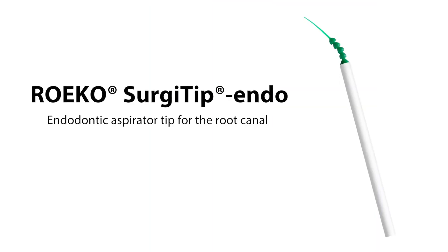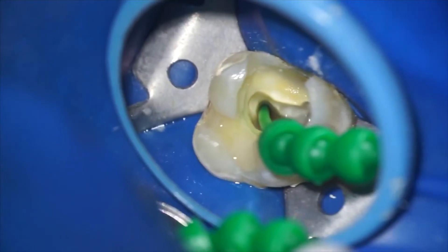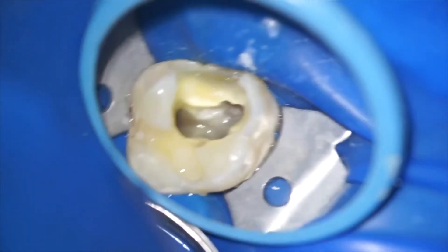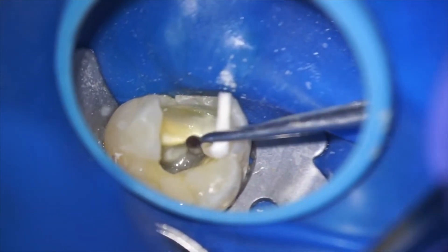One of the methods by which we dry the canal involves a micro suction called Surgitip Endo, which is a small suction that attaches to the saliva ejector and removes most of the irrigants from the canals. We can then do a final drying using sterile paper points of various sizes.